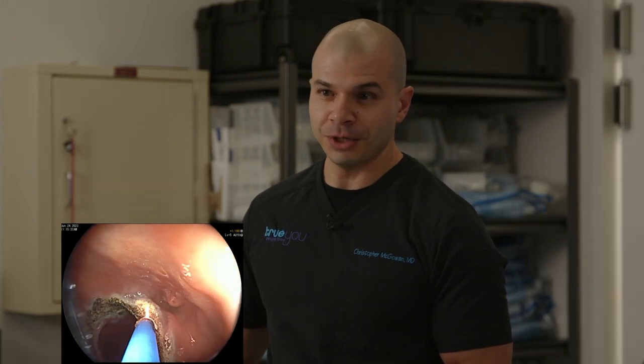Complications are extraordinarily rare with this procedure, which is one of the main advantages. But we want to aim for tight. The tighter the better, to a point. And a lot of patients come to us and say, make this thing as tight as you possibly can. And obviously, we could close this off completely. We don't want to do that. But we are going to aim for 8 millimeters, and you'll see the difference.